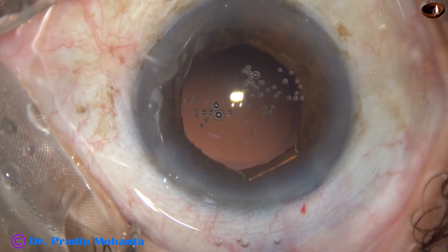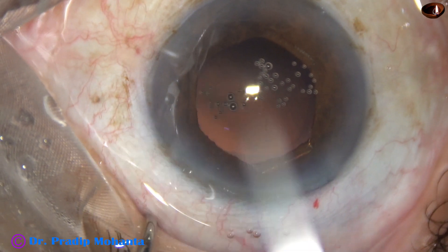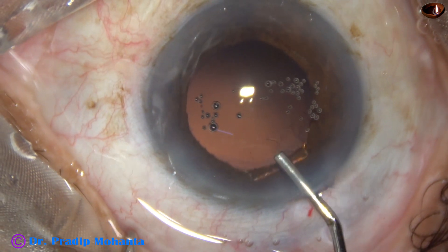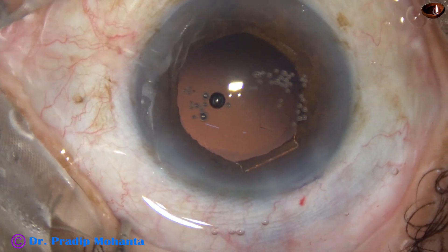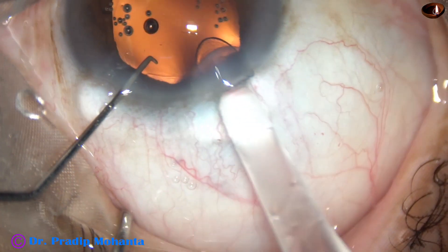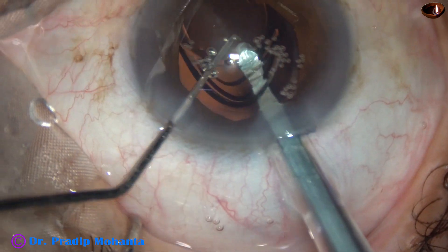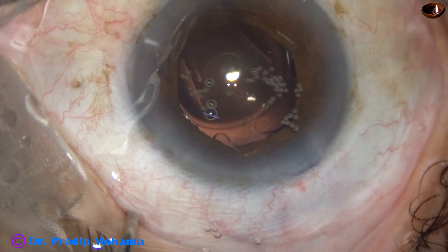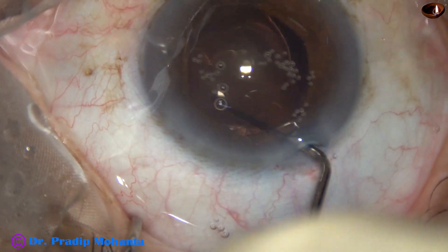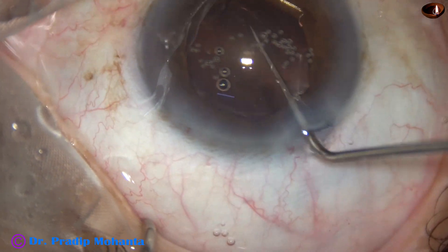There are a lot of minute air bubbles sticking to the corneal endothelium. At this time the bag and the anterior chamber is filled up with viscoelastic. Here goes a monofocal single-piece hydrophilic acrylic intraocular lens. The lens has gone into the capsular bag. The lens is rotated so that the optics are about 90 degrees away from the main incision.